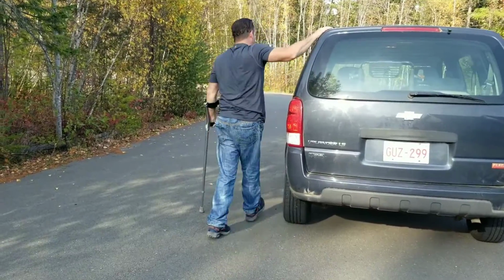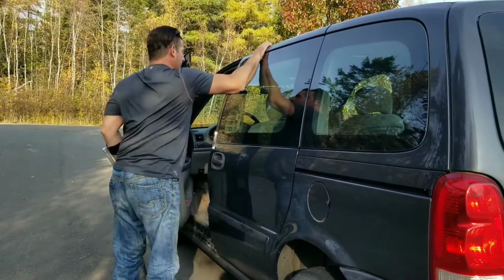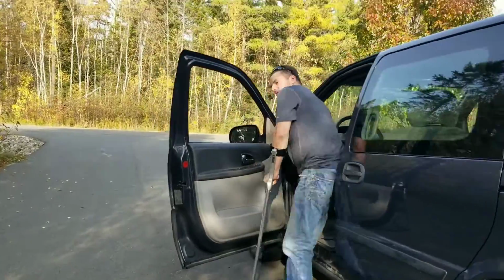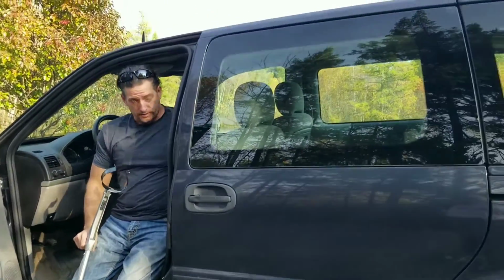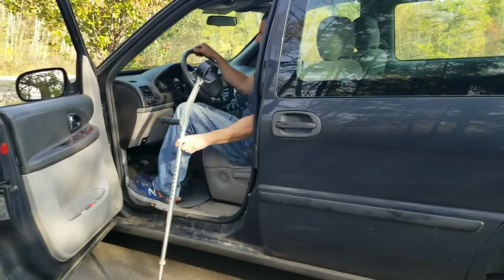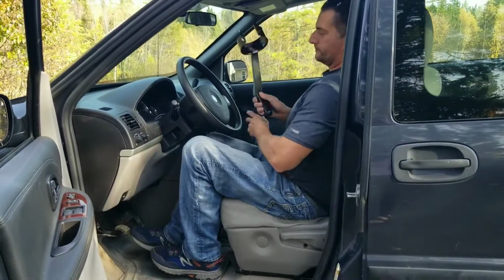Then I'll walk around, always grabbing up top for my balance. If I had two crutches, I'd be fine walking across, but I only had the one, and I just used the top of the van to help guide me around. And again, just put your legs in, crutch. There you go.